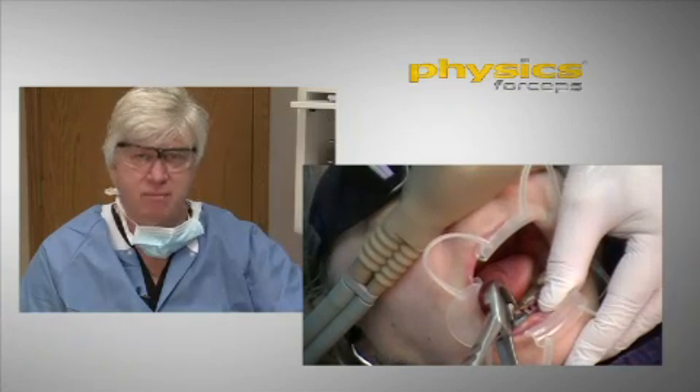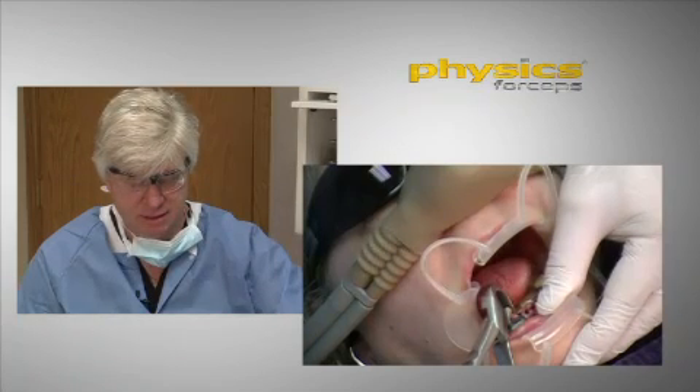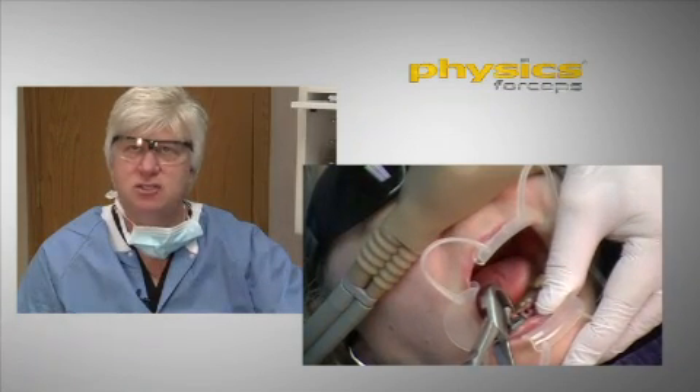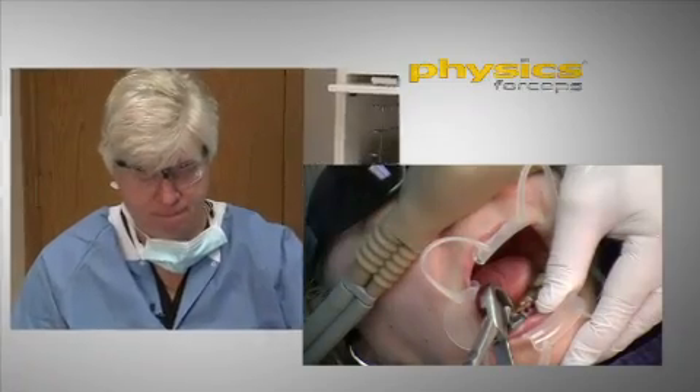Taking a minute or two for a dentist is often times very difficult, but if you take your time, we don't break any buccal bone or facial bone, and the teeth will come out really nice. Preserving these sockets is critical for implant dentistry. Our patients are often just amazed how simple these extractions go.